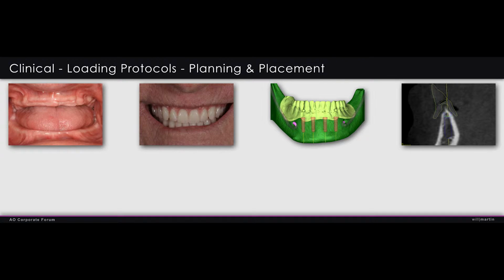And this is kind of tying a little bit of digital dentistry into what we're doing now in our practice. And you can see this is a double scan where we plan the implants. And I don't know if everybody in the room can see here, but there's an outline of the denture. And then you see his ridge, and the implant's placed at an adequate vertical position to allow enough restorative space for our framework, our materials, and a stable set of prosthesis that's not going to give us problems.